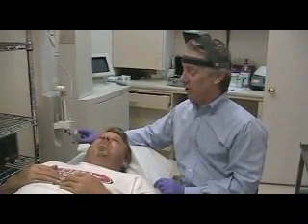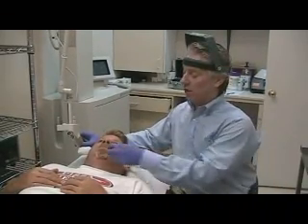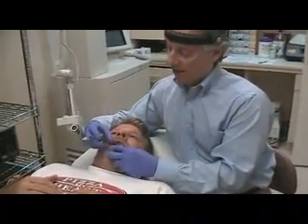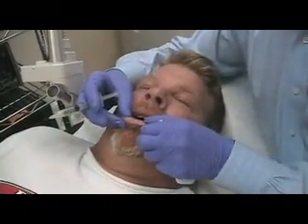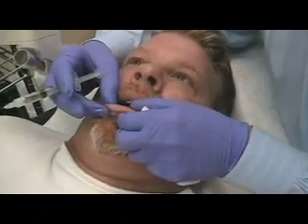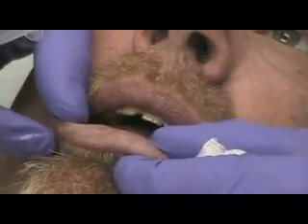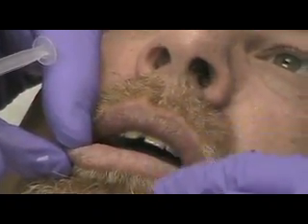So what we have here is a 41-year-old male, lots of sun exposure, and he's getting some breakdown of his lip here. He gets this lesion, especially when he's in the sun. And this actually looks like cheilitis, and this was what the CO2 laser was originally used for — to treat some of the sun damage in the lips. And so that's what we're going to do.